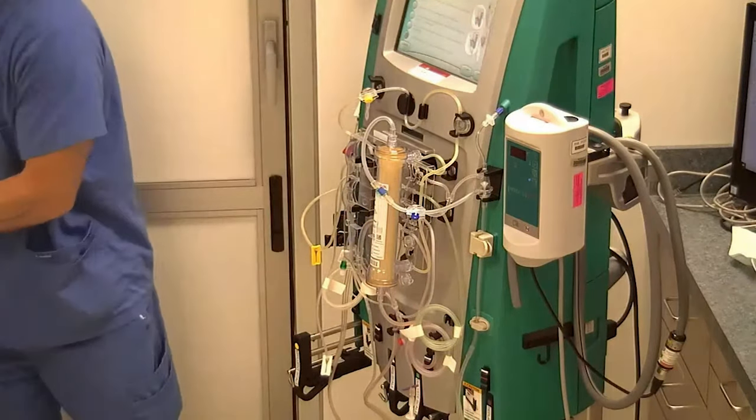And when you push in one of these scales, you also want to hear it click again. And when you hear that second click, that confirms that the sensor is recalibrating on that scale. So from here, we've done all of our steps. We followed it in the direction that the machine wanted. And now we're going to hit the load button.